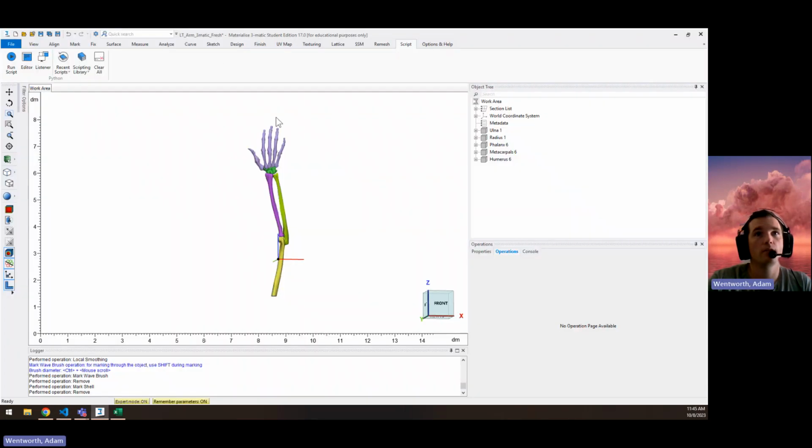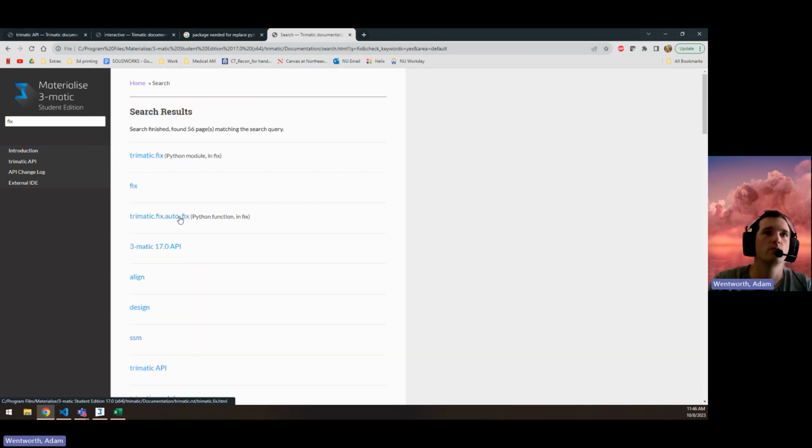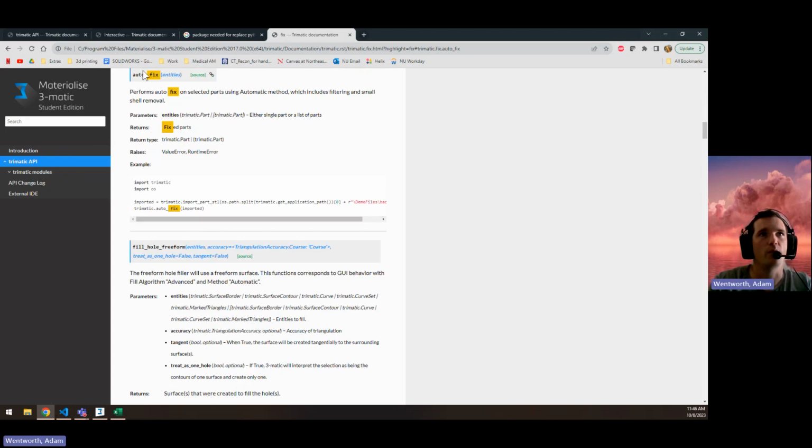And if we look at the, here it is. As we look at the 3-matic user interface, this API is reachable by the options and help tab, and click on the scripting guide. This is where we search for any functions that we want to do, and then we would come up with a list of functions we could click on, copy and paste these functions into our IDE for use.